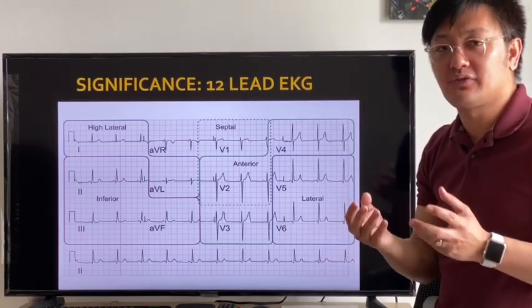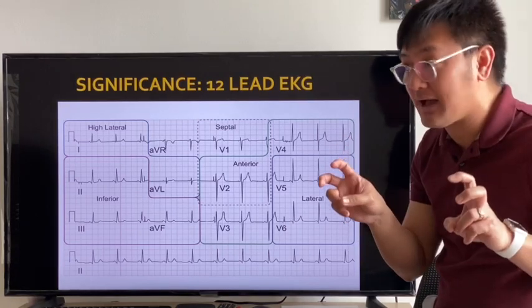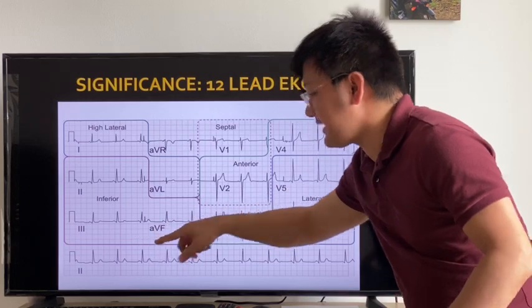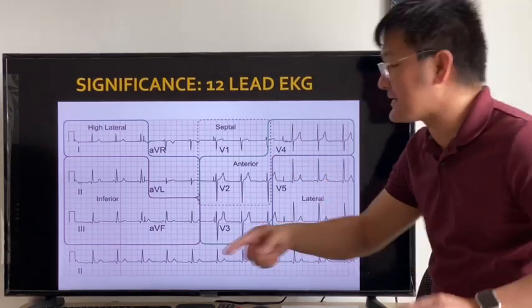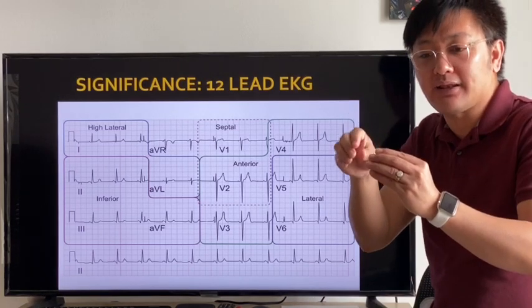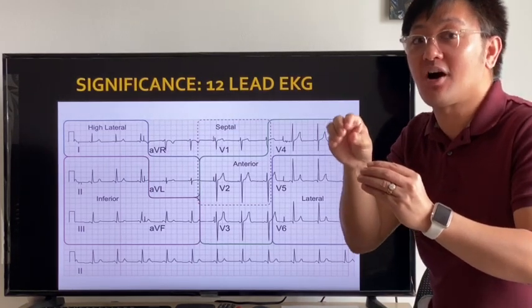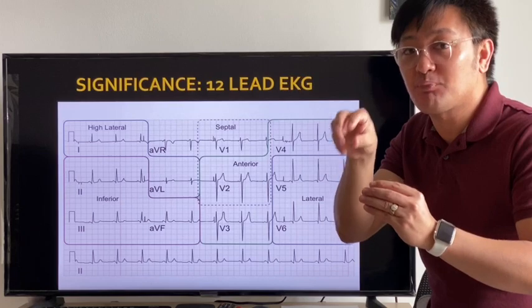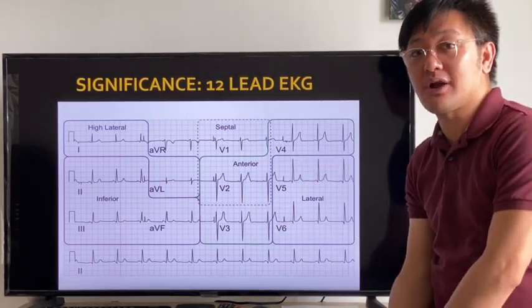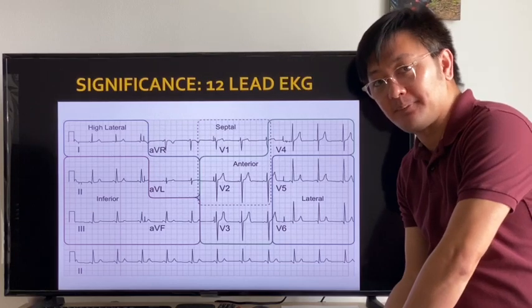If you will have inverted T-wave, which is ischemia, in your lead 2, lead 3, AVF, you know that ischemia happens in the inferior part of the heart. Can you follow? And you have to correlate what specific coronary artery supplies the inferior part of the heart. And I will have a separate discussion on that, the coronary blood supply of the heart, okay?